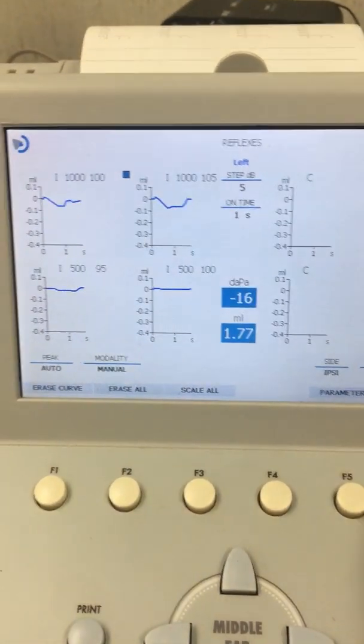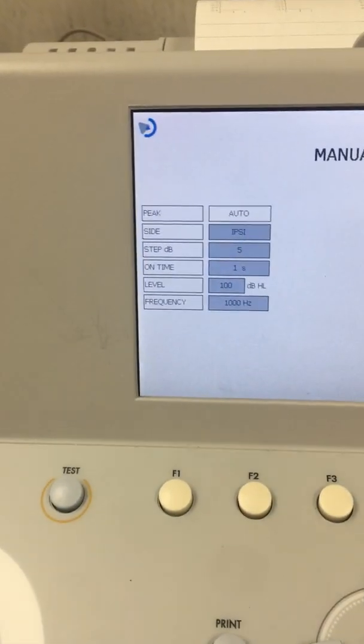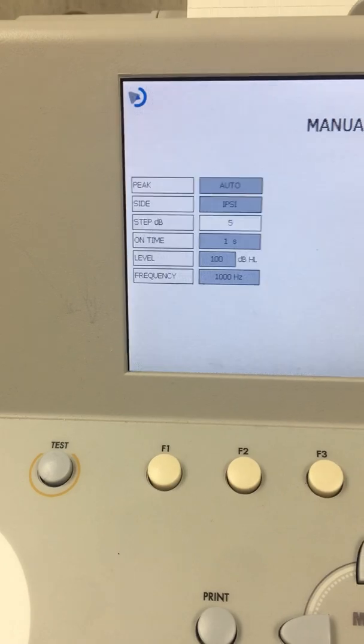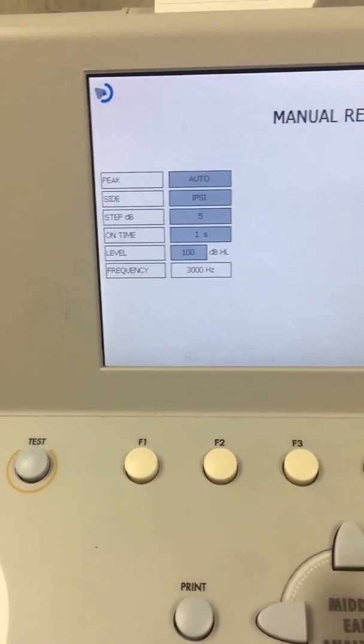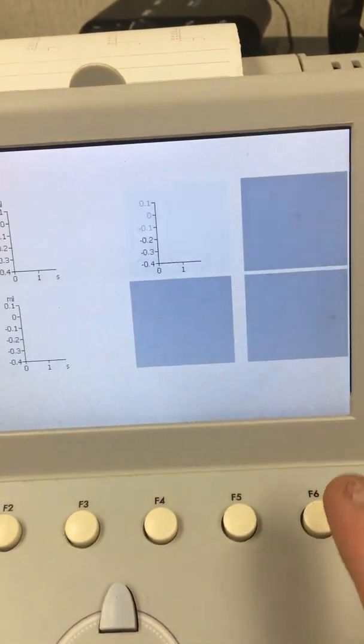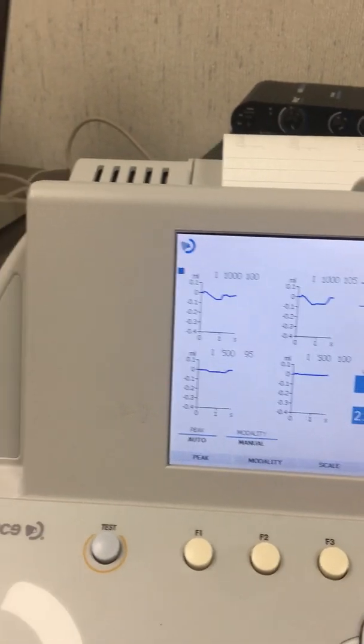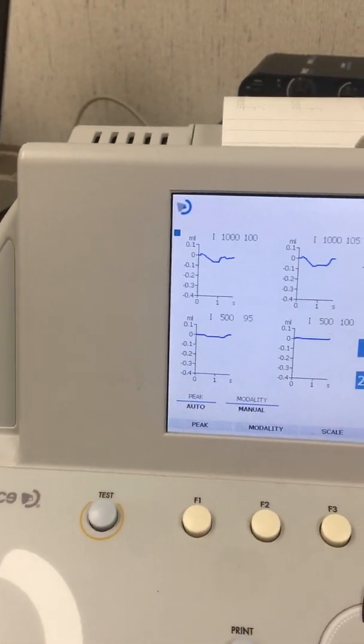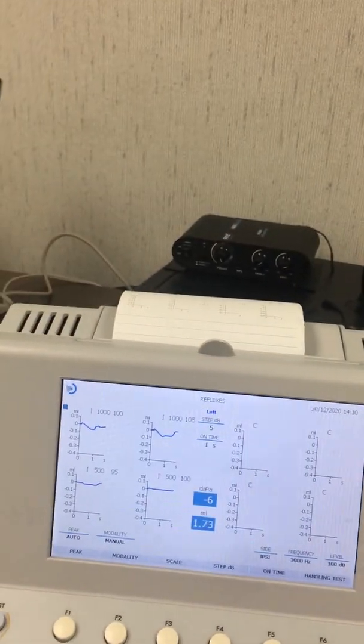And if you want to switch to another, just hit handle test F6, F5, scroll down again and do a thousand, two thousand, three thousand, whatever you want to do. Then go to test, make sure you switch to the left side, make sure it says ipsy, and press your start stop button.